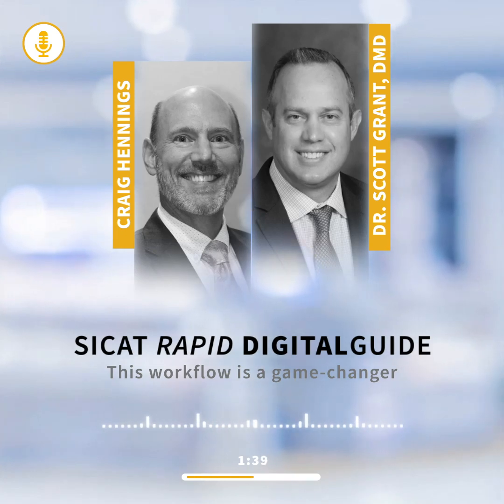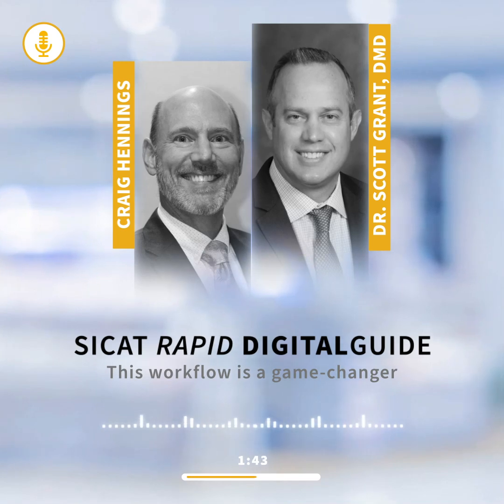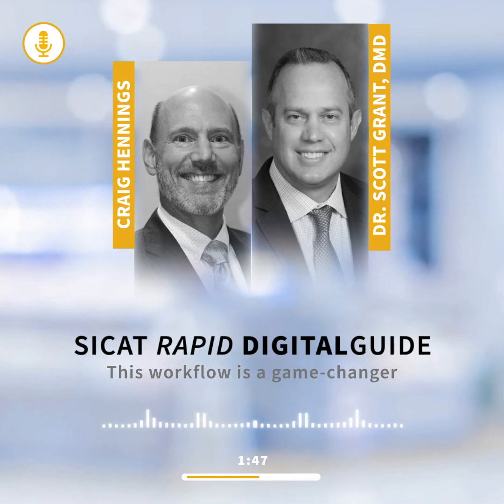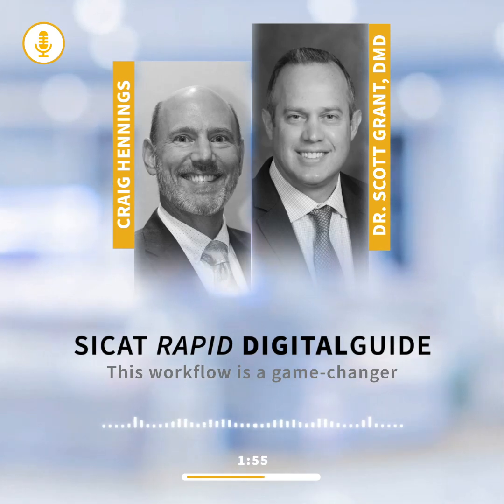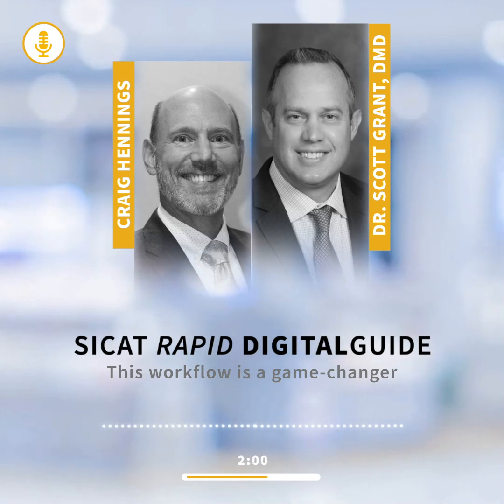Yeah. Even to extend that, if we end up using a healing collar versus a cover screw, we'll save the guide. They come back in the time they need to, whether that's 30, 90 days later, and we put the guide on, we tissue punch right through it. We didn't have to guess. We didn't have to mess with it. And it's 100% seamless. So their pain is reduced incredibly by simply using the guide during surgery and for finding the osteotomy to do the tissue punch later. So they're happy. Patients are super happy.